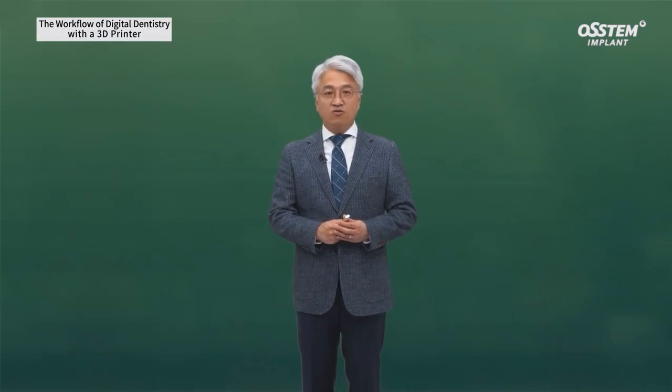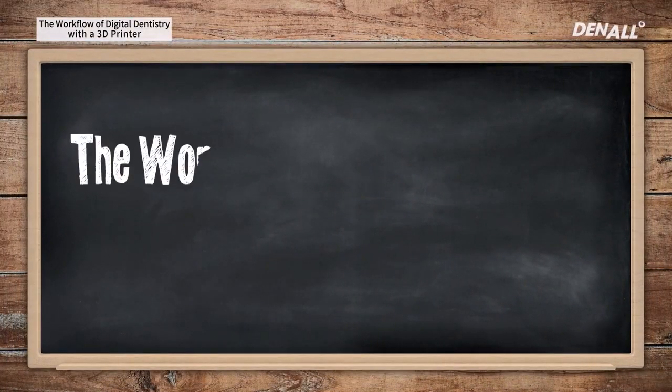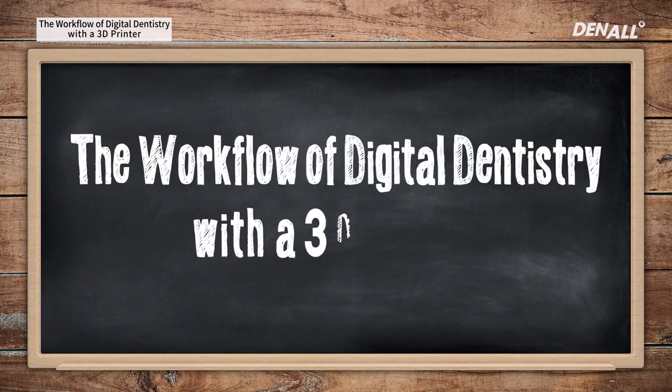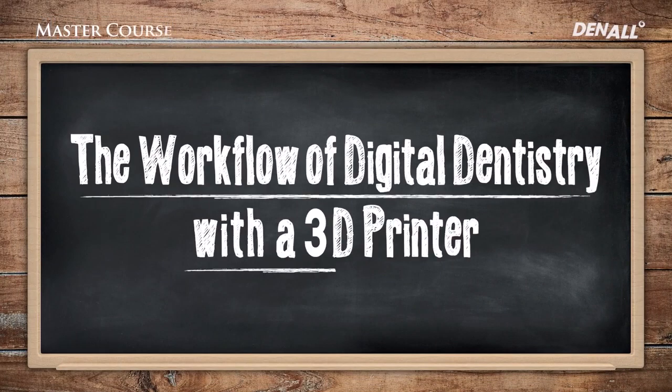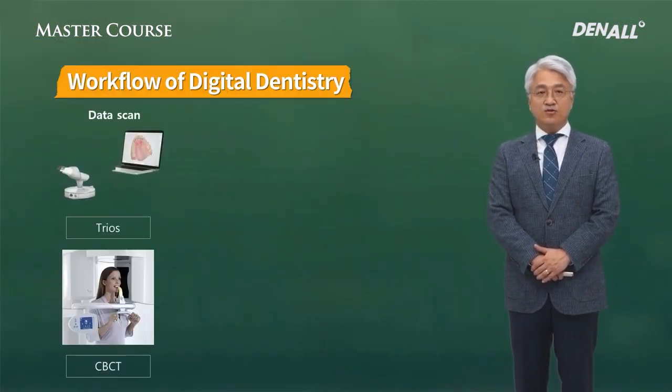Today I'm going to talk about the workflow of digital dentistry utilizing 3D printer. Scanner and CT are used to gather data.